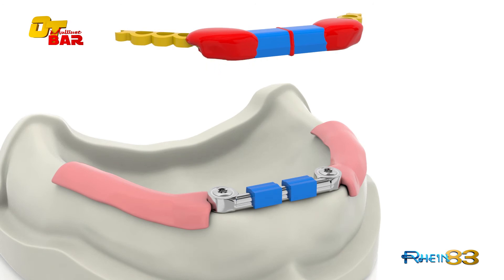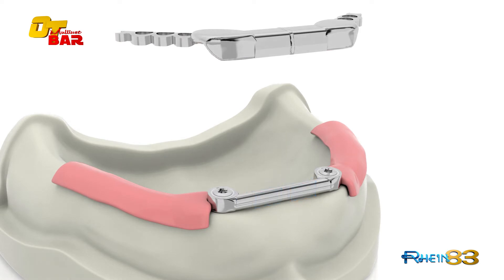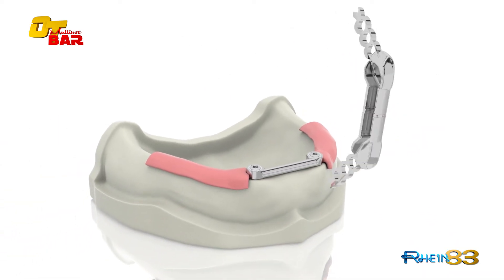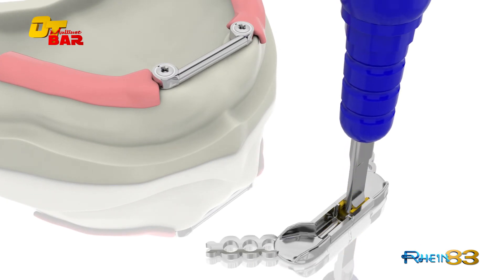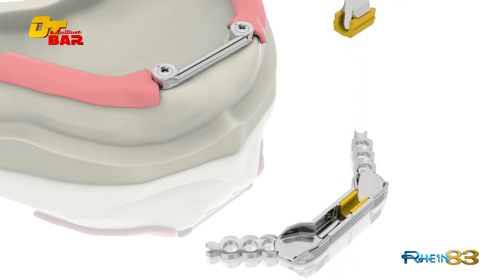Remove the silicon tape from the castable frame and cast. Insert the proper retentive clip into the frame and finish the denture.